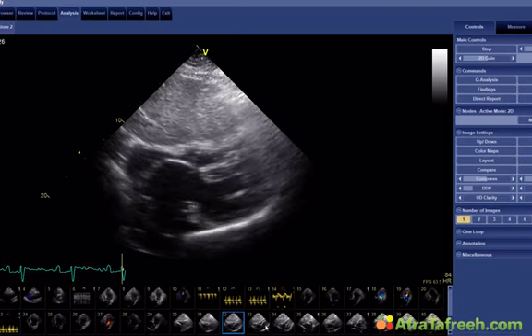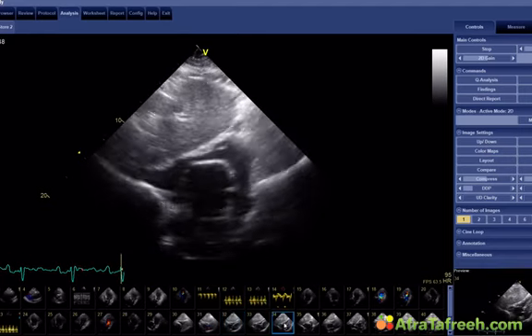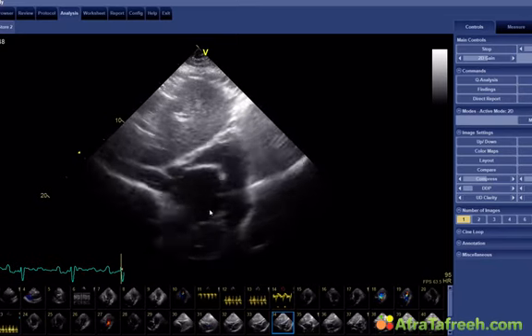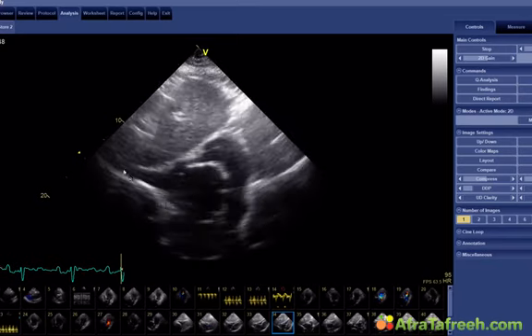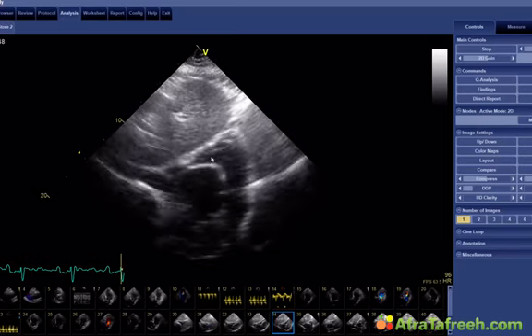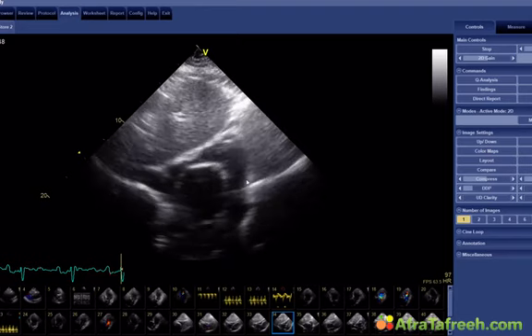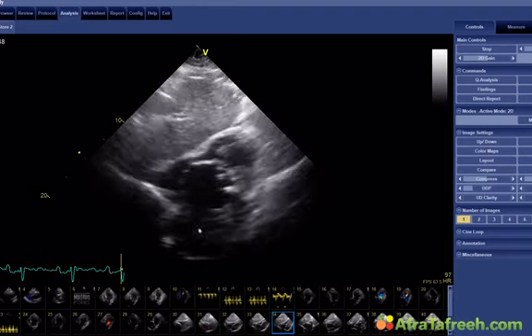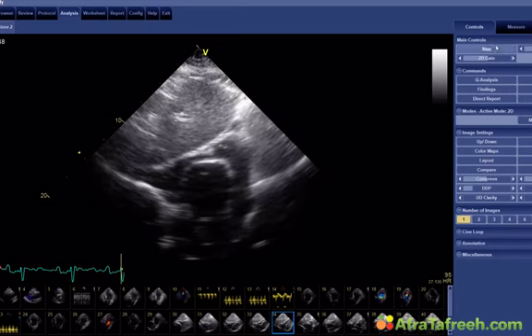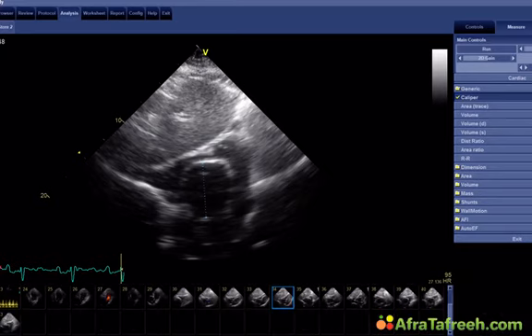Okay, so this is the tricuspid valve somewhere in here, which is pretty compressed actually. This is a short axis view from subcostal, where you can see the inferior vena cava, the right atrium, tricuspid valve, and down here would be the pulmonary artery and the pulmonic valve. And at the center, again, the very large aorta. Let me measure that for you again. Okay, so we get a pretty similar measurement of above 50 millimeters.